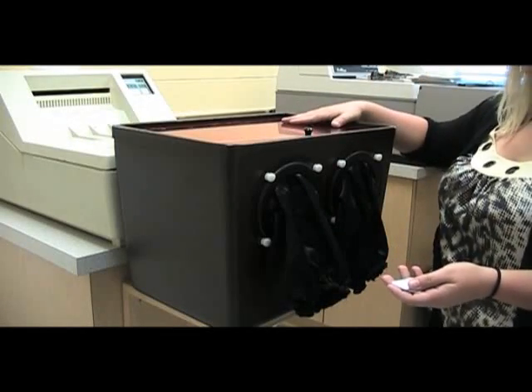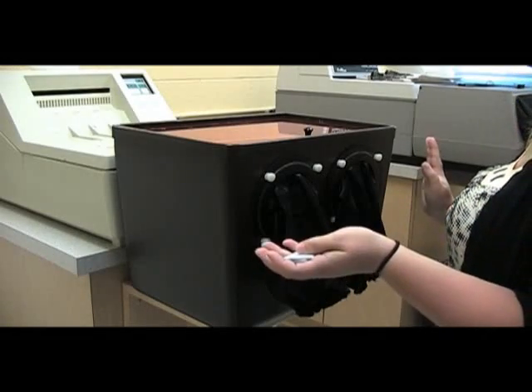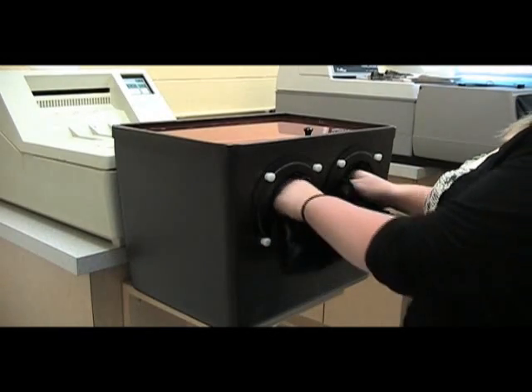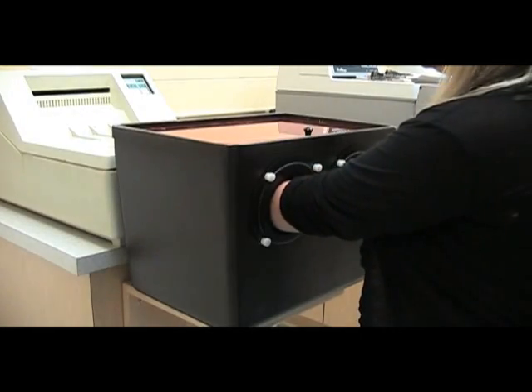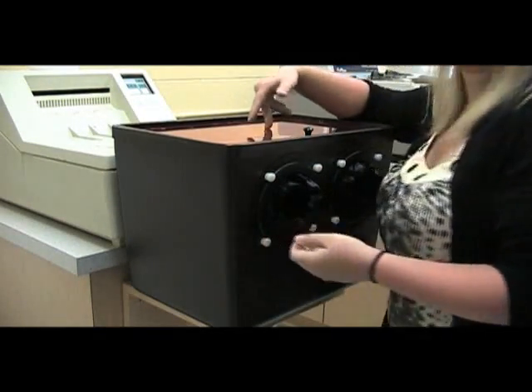This is our daylight loader. You take your film and you should not be wearing your gloves — clean hands only. This is where you insert your hands into this area. You can look over the top of what you're doing so that you can see.